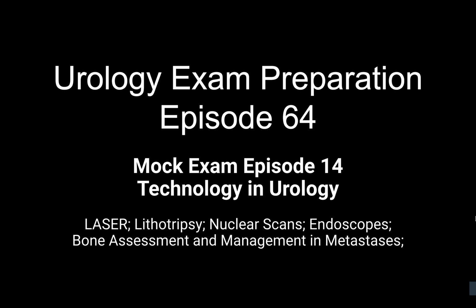Okay. Are these disposable single-use scopes available in other areas? What other areas in urology? So there is a disposable flexible ureterorenoscope, which is used for treatment of stones in the kidney, or even treatment of small lesions in the renal pelvis.